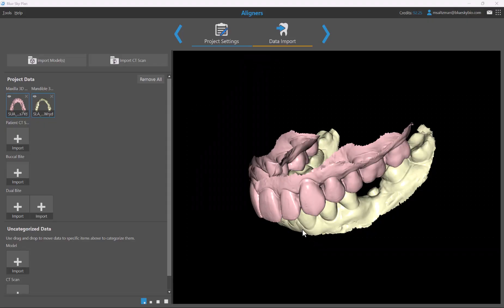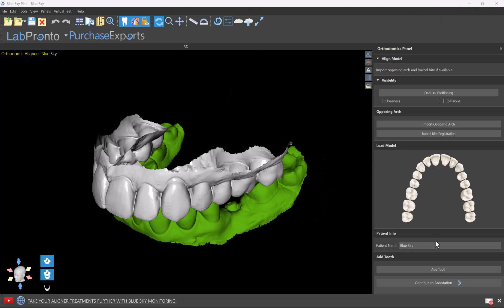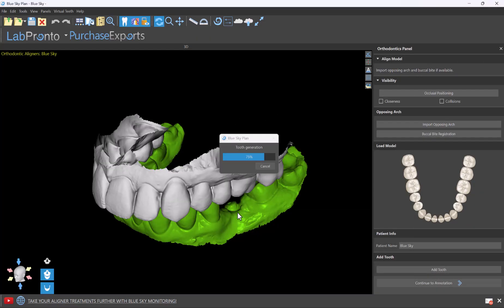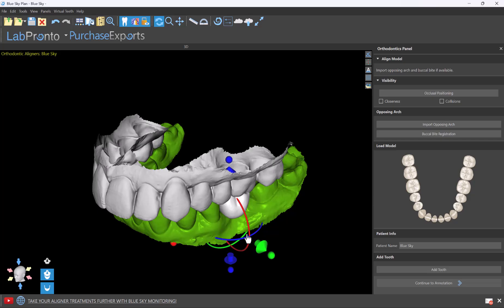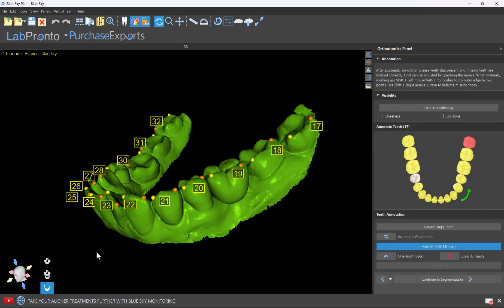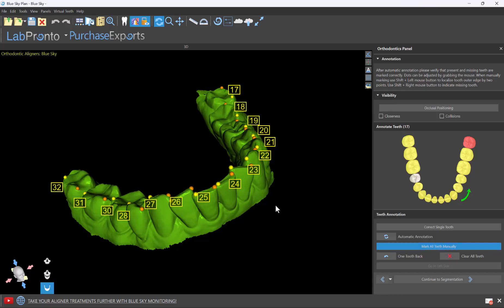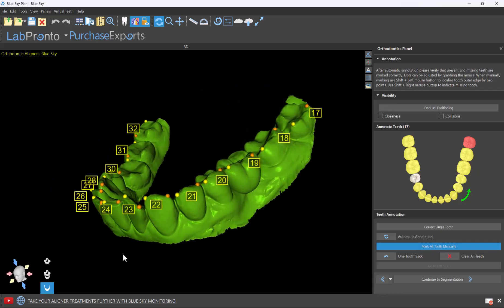In situations where a tooth is missing on the models, simply click the Add Tooth button, indicate the location of the missing tooth, and the software automatically generates an AI tooth based on the anatomy of the adjacent teeth and the opposing arch. The tooth added for the missing tooth is now incorporated as if it was part of the model.